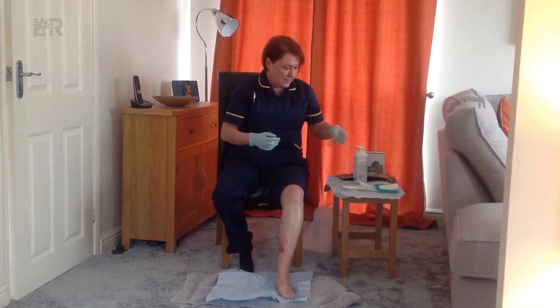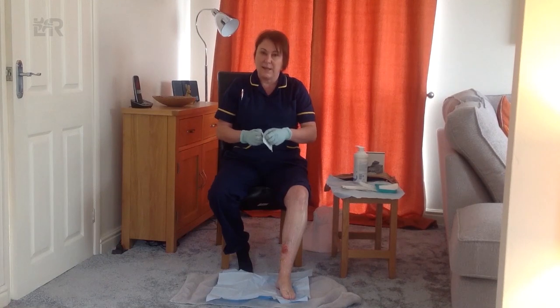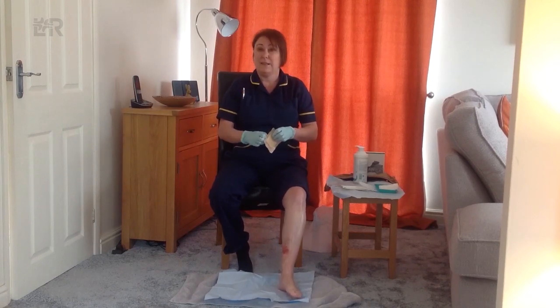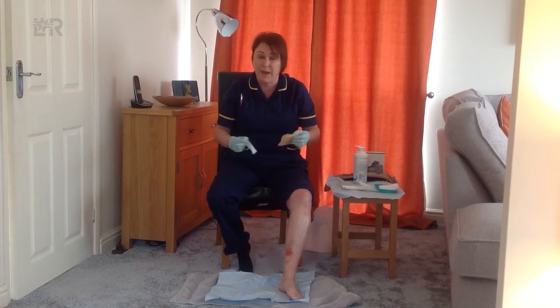So the dressing — there are various different types of dressings and your nurses will advise the ones which are prescribed to you and how to use them. This one is a silicone type dressing and it has a backing on it, so I'm going to peel the backing off — it's easy to apply. It might be that you have a primary dressing, which is a dressing that goes underneath this dressing into the wound bed.